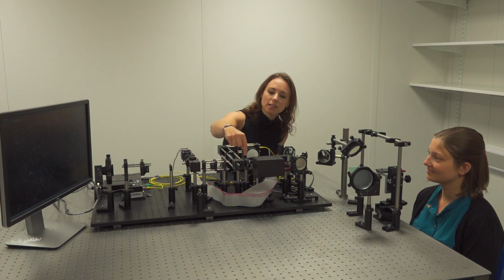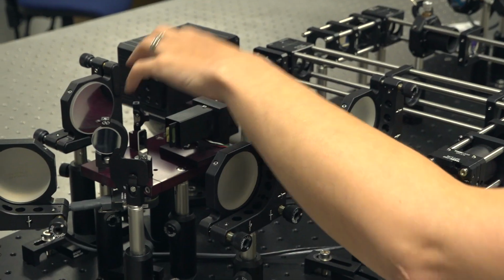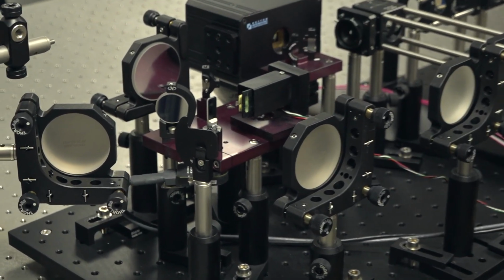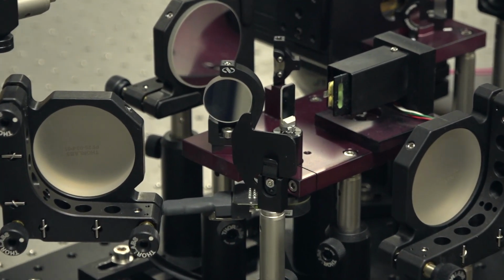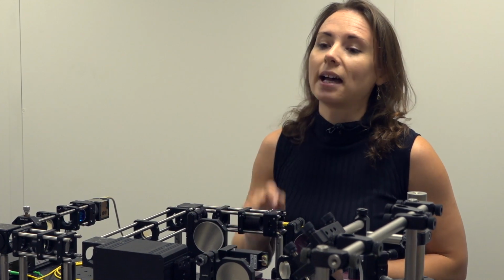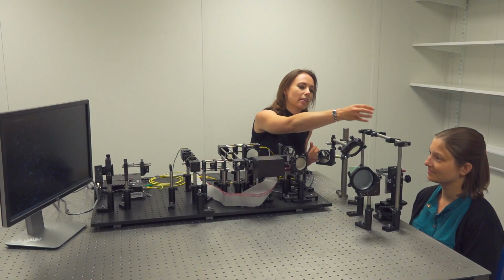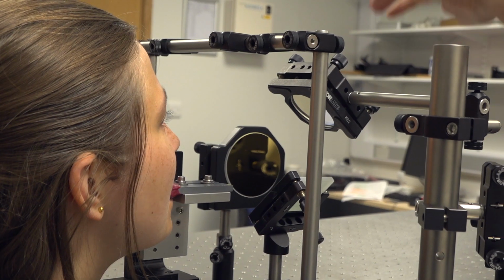So the laser is directed into the eye via these lenses and mirrors, and via these 2 special mirrors that scan the beam. So one moves the beam horizontally, the other moves it vertically, and together they trace a rectangular patch on the retina. Then some extra mirrors relay the light into the participant's eye.